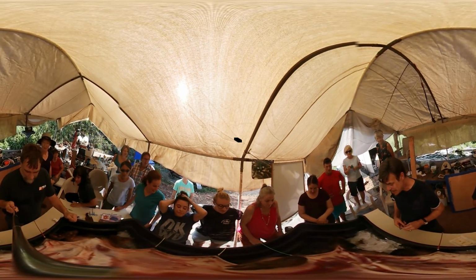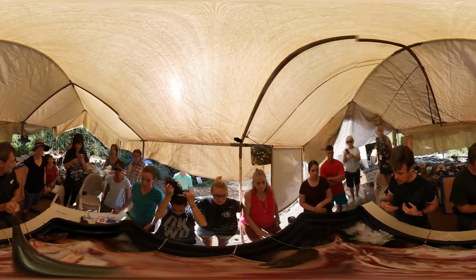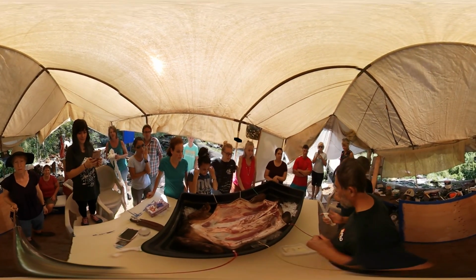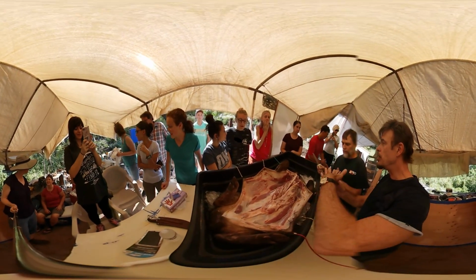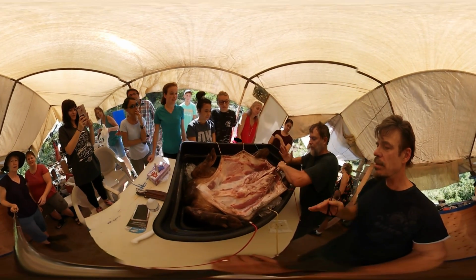All right. So I think the next thing is that we just need to now go further in, open them up, and we need to start up here so we can get into the. You're going to go through the sternum? Well, do you want me to open up the lower guts first? I think if we can open up the sternum, then we'll also get more.